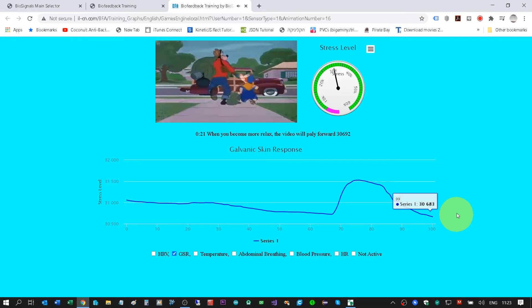The temperature training is a little bit different. When the line goes up, which means temperature goes up, the sun will go up in the video. When the temperature goes down, the sun will go down. Abdominal breathing — it's a very simple training.